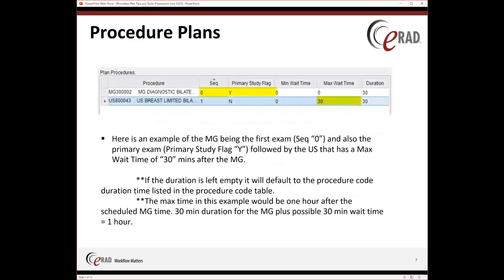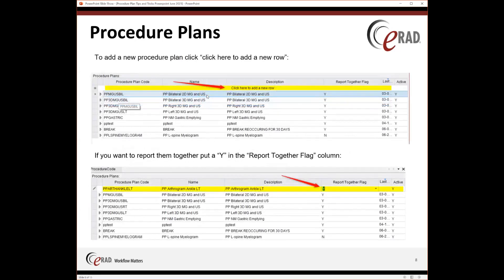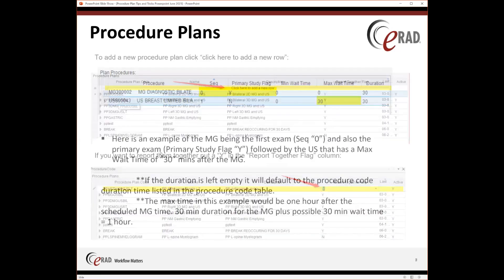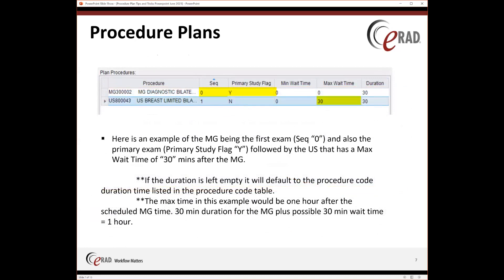In this example, the MAMMO is set at zero, the primary study flag is set to Y because the MAMMO is going to be the primary study, and the maximum wait time highlighted is set at 30. Basically, what that means is that the ultrasound could be scheduled as late as 9 o'clock if the mammogram is at 8 o'clock — but it could also be scheduled at 8:30 or 8:45 as well.